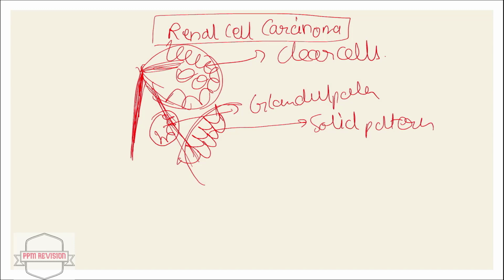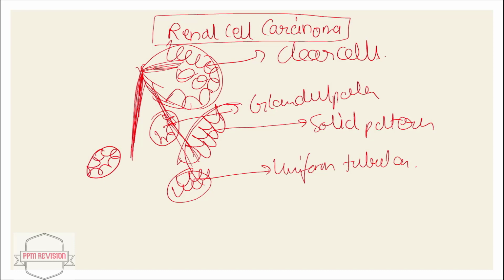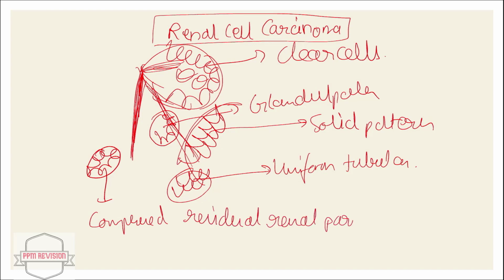There's also uniform tubular cells that are seen, and there's presence of compressed residual renal parenchyma.